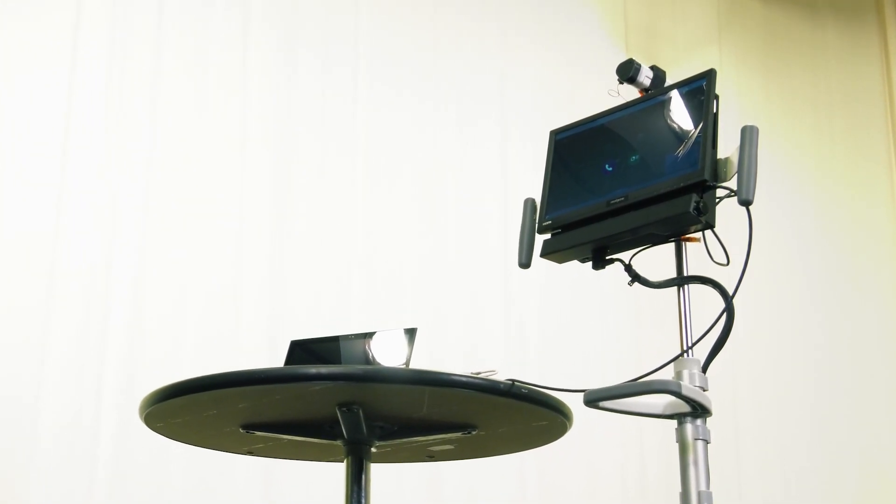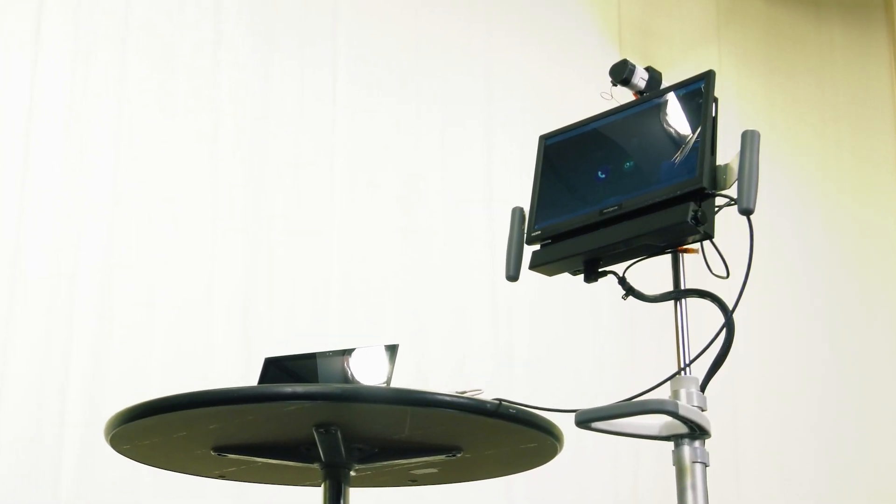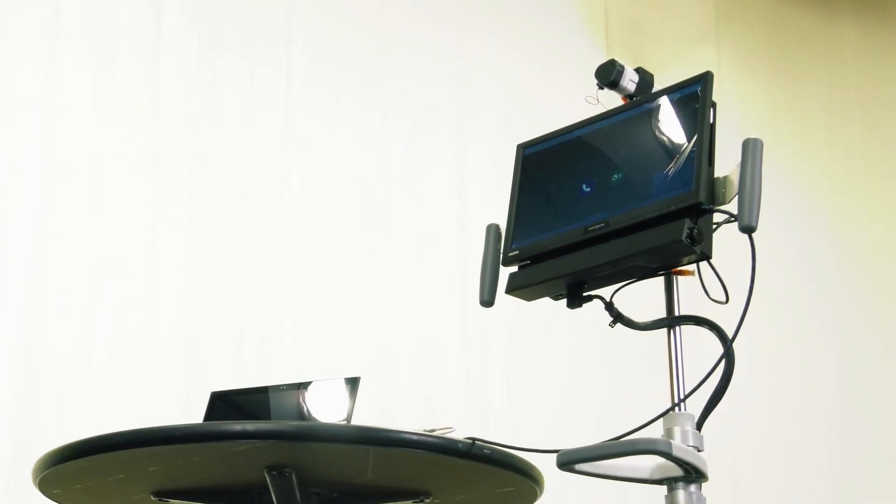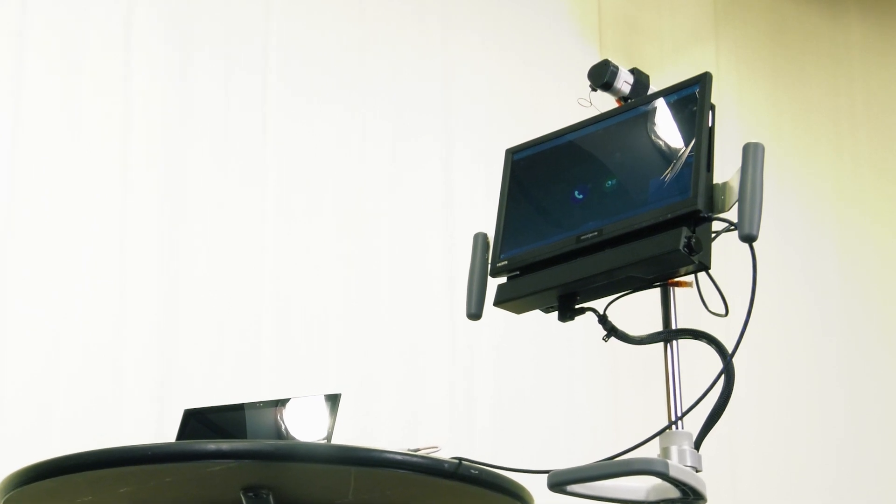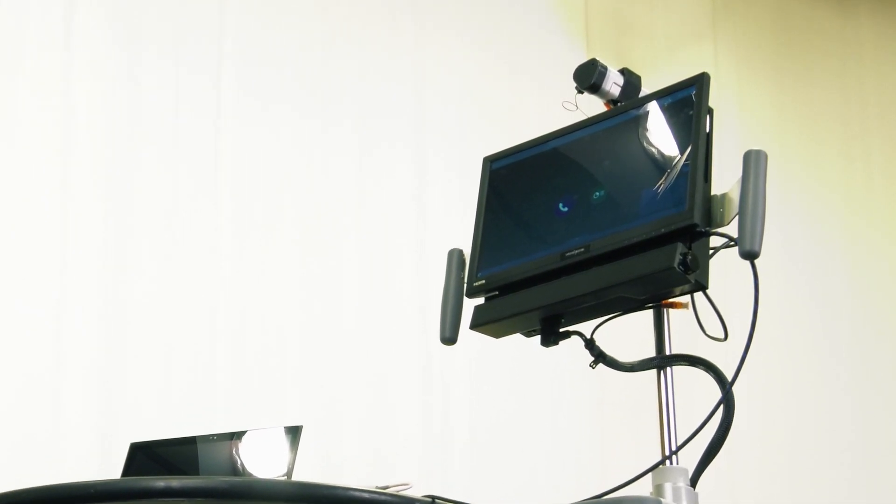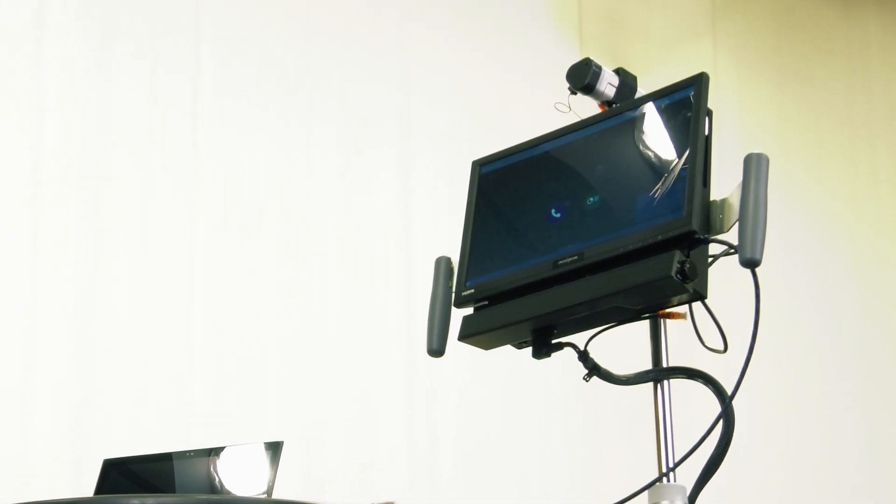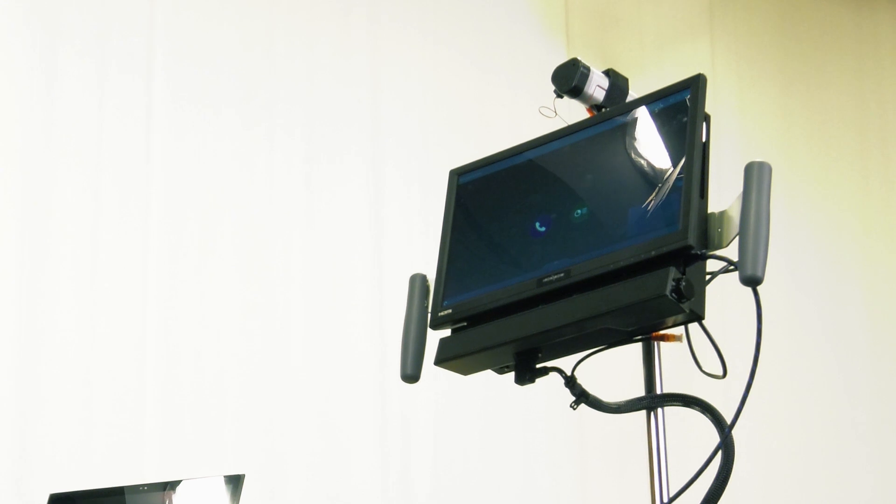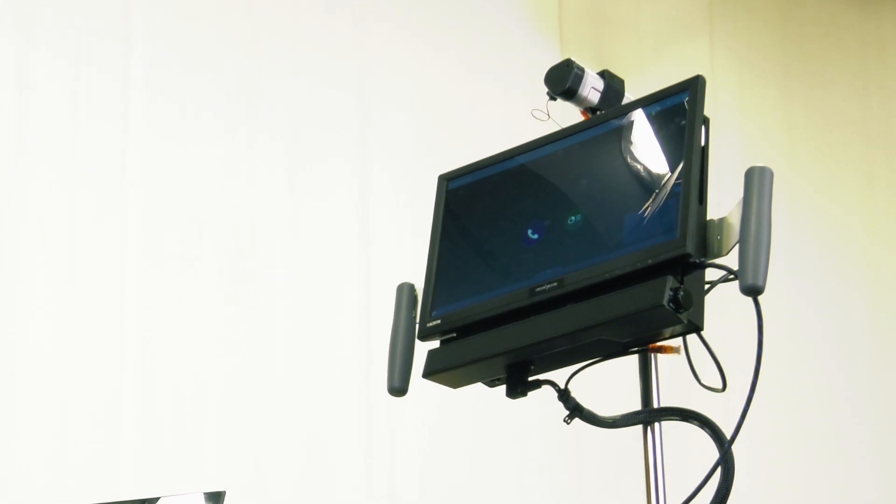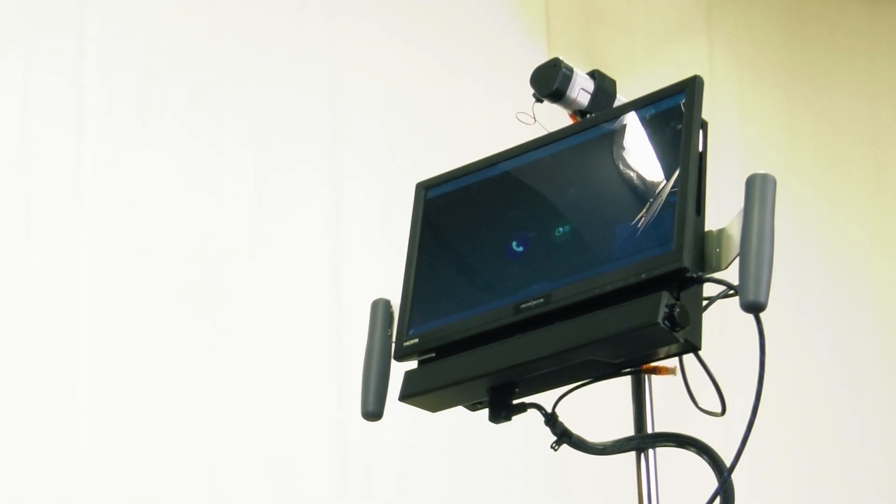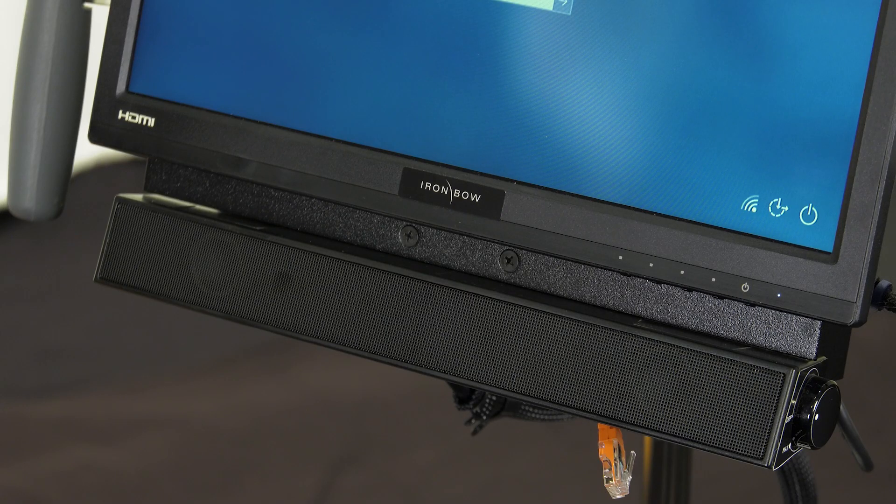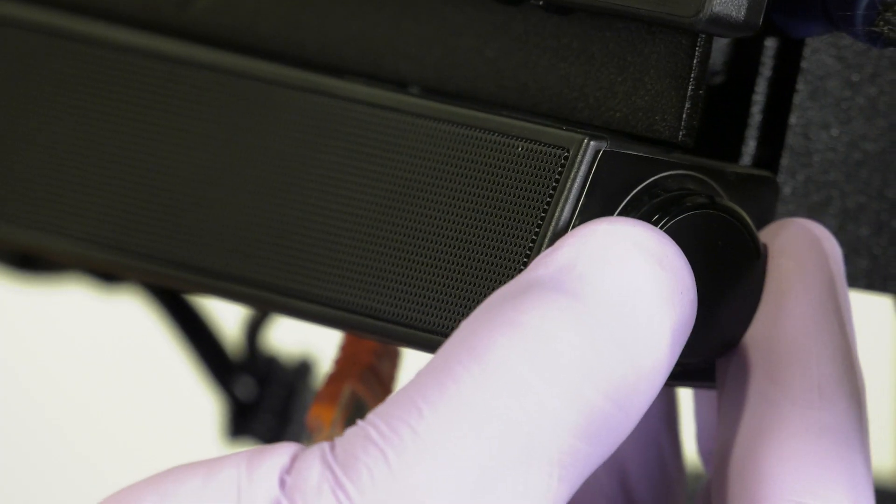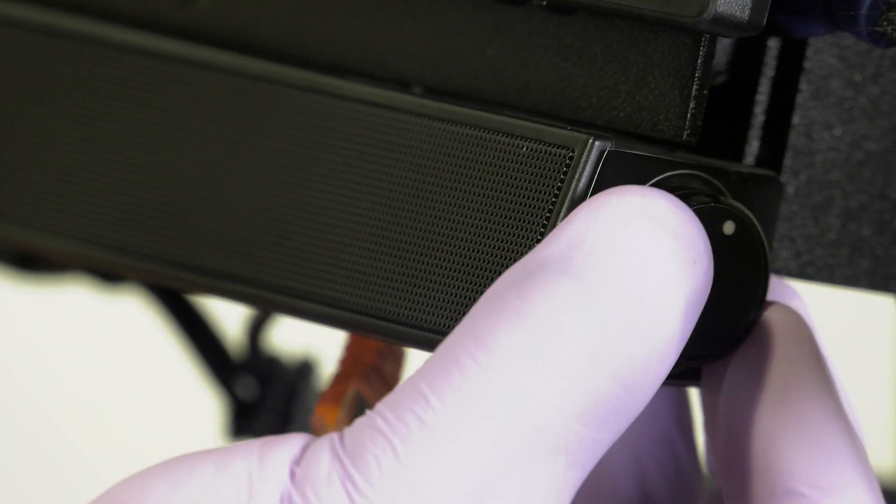Through the touchscreen, users can answer and make video calls via Zoom. The touchscreen displays the contents of the Polycom Group 310 codec attached to the back. Attached to the bottom of the screen is a speaker, which has volume controls on the right-hand side.